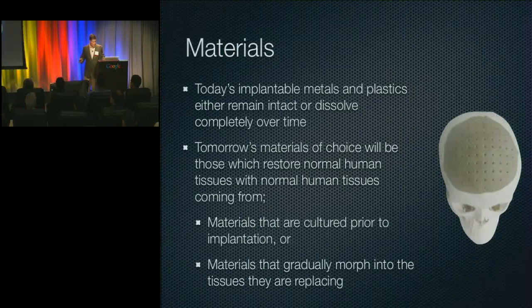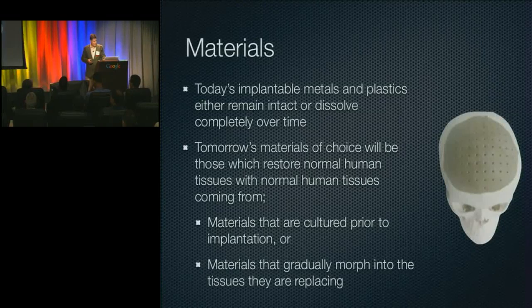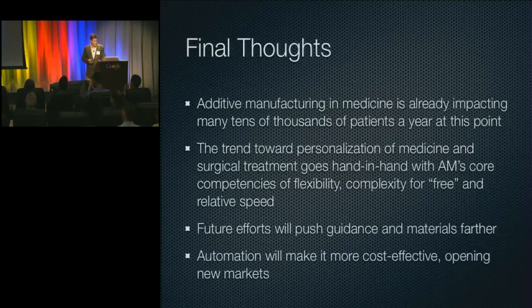And the same for materials. This is actually a PEEK part. PEEK and PEKK are really moving into high fashion within the medical area, and PEKK, specifically additively manufactured, should be where things go.